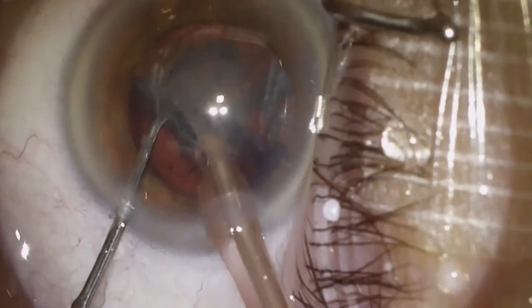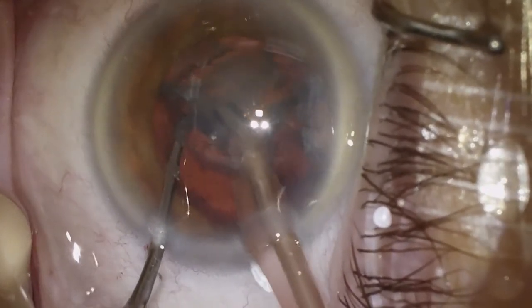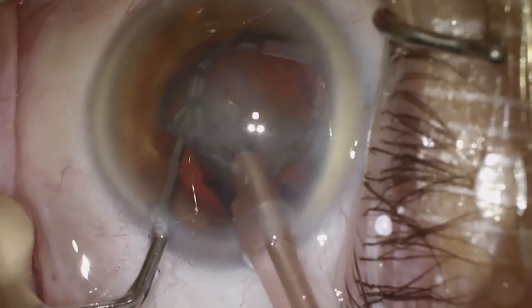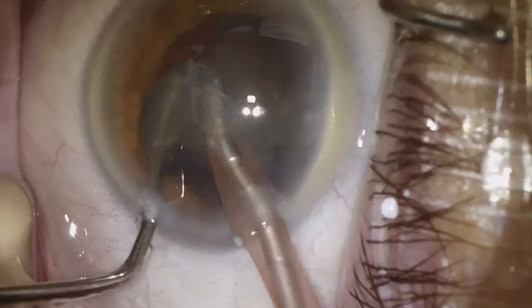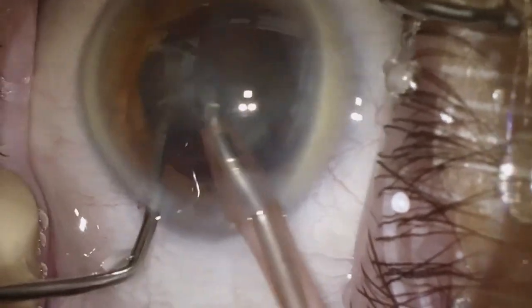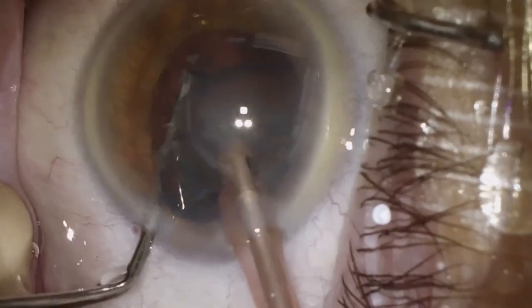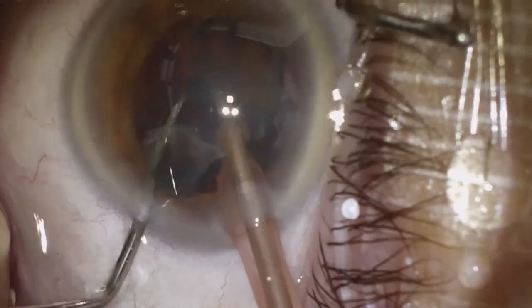You'll notice that I'm going to use my second instrument here to protect the posterior capsule. I'll keep that between my phaco probe and the posterior capsule in order to decrease the likelihood of posterior capsular rupture. So making progress, taking our time. We're removing the last quadrant here, the last piece of the nucleus. And things are going well for this patient.